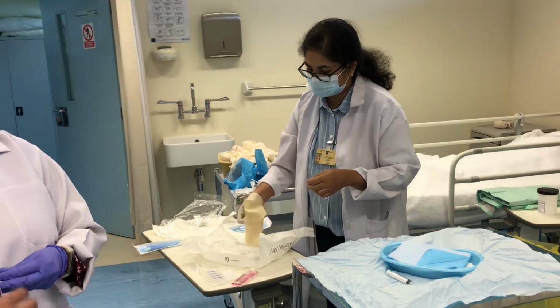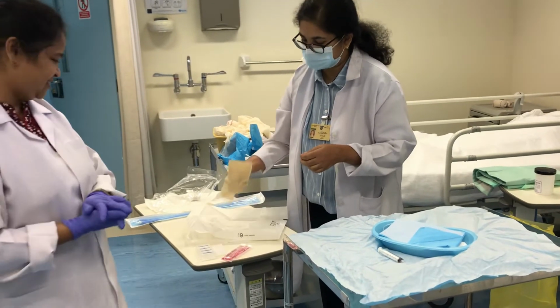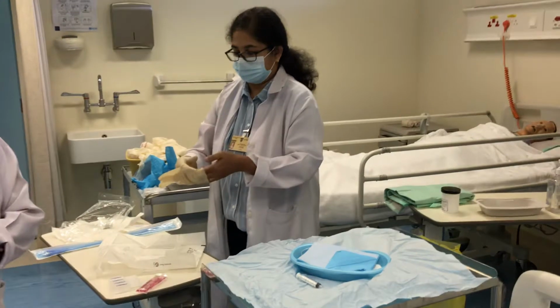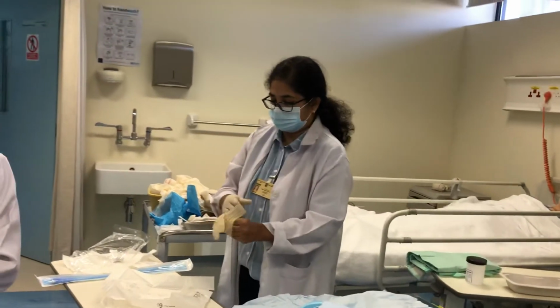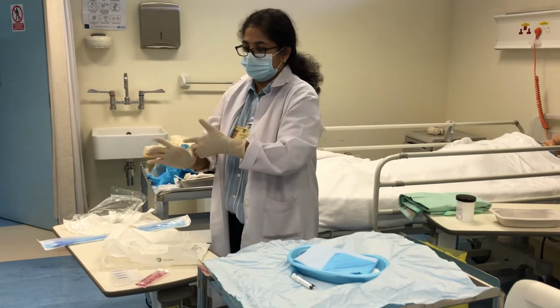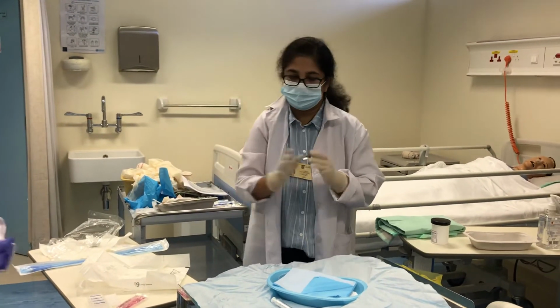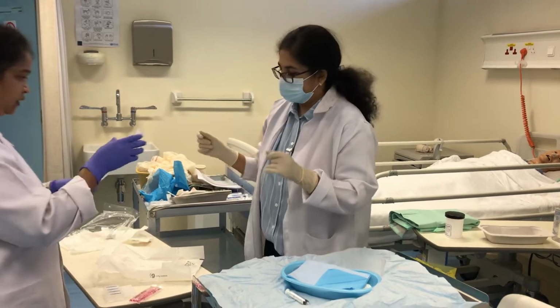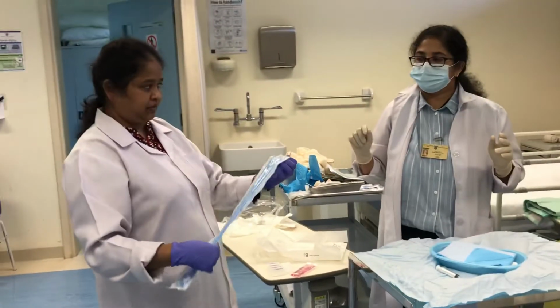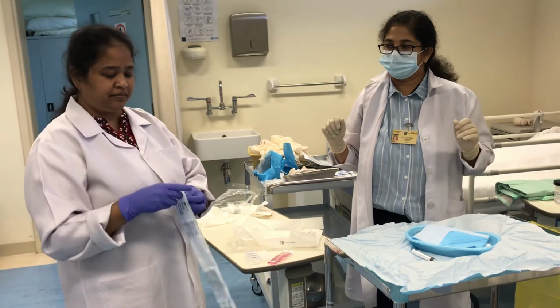Tighten it. Yes, you can take, because when we are trying to put, we may make it unsterile. So if she is wearing gloves now, it's easy for me to give it to her.